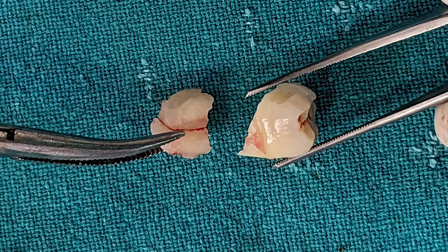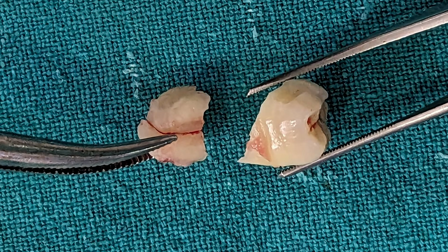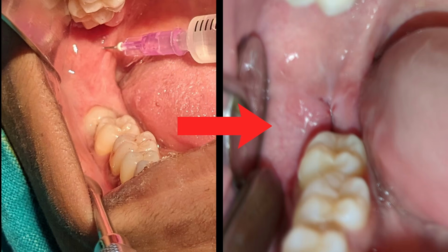As shown in the video, the section is not straight, but it doesn't matter as the tooth is out with minimal bone removal without any issue. 6 days post surgery, the sutures were removed, and this is how the healing was at that point.